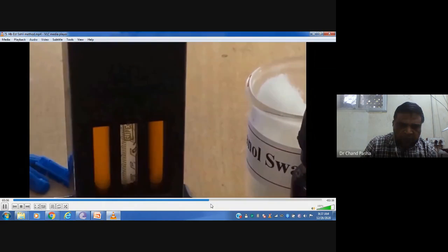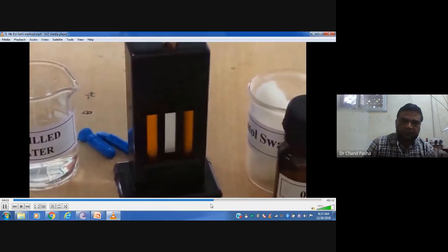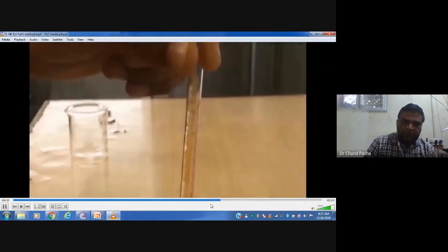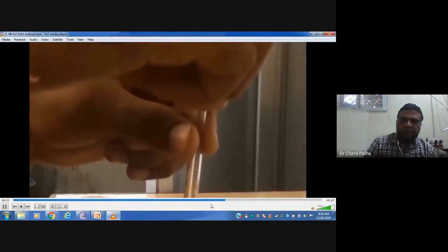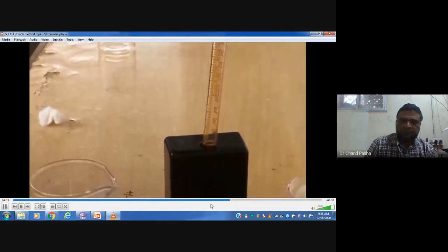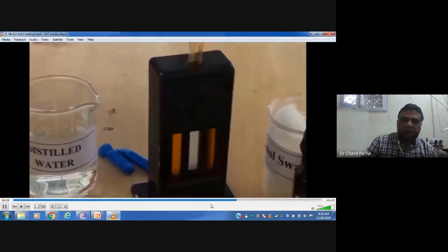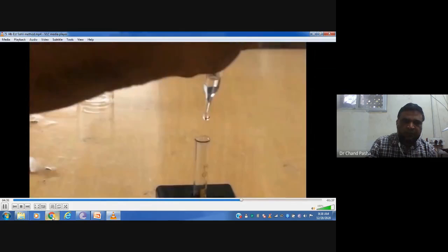See here, the central tube will be having percentages as well as grams readings. Total 15 is taken as 100% in case of male, and 13 is taken as 100% in case of female. Ten minutes digestion time is there. Once 10 minutes is over, then we are supposed to adjust the color by adding the water.